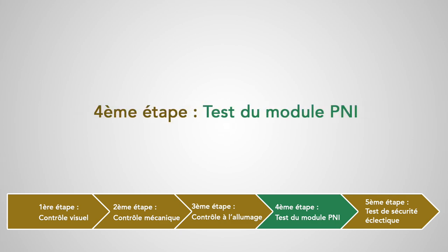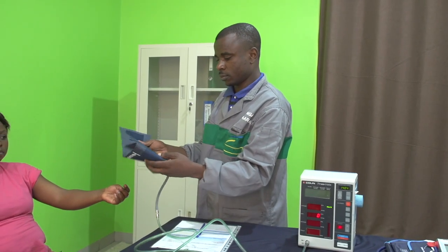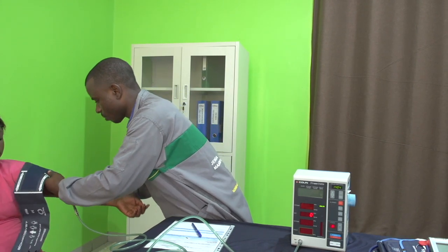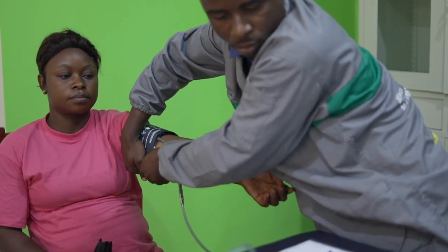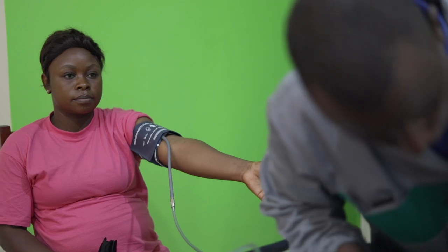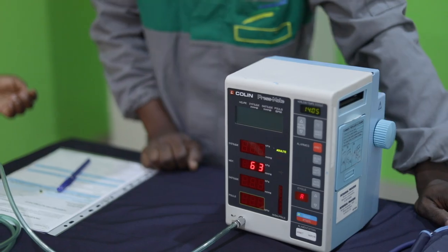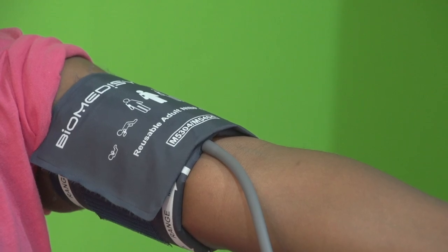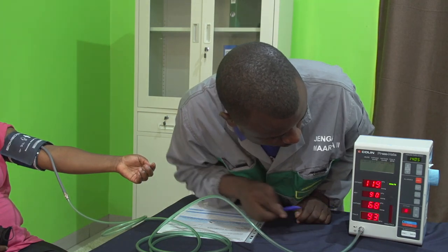Quatrième étape : test du module PNI. Dans un premier temps, on va mesurer les valeurs des pressions artérielles avec le tensiomètre automatique à tester lors de cette maintenance. On peut faire ces mesures sur une autre personne. On place le brassard autour du bras, 2 cm au-dessus du pli du coude, et on lance la mesure PNI en appuyant sur le bouton correspondant. Le brassard se gonfle et se dégonfle automatiquement. On note sur le compte-rendu des tests les valeurs des pressions systoliques et diastoliques.